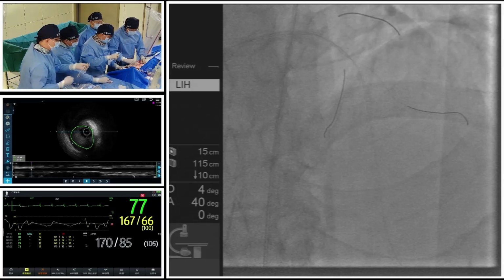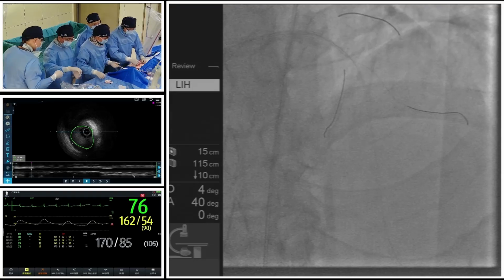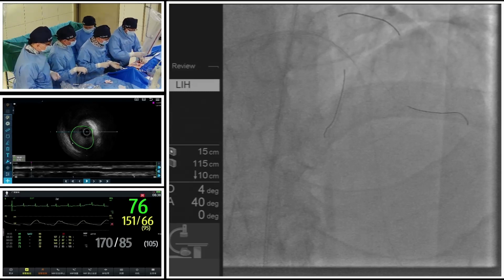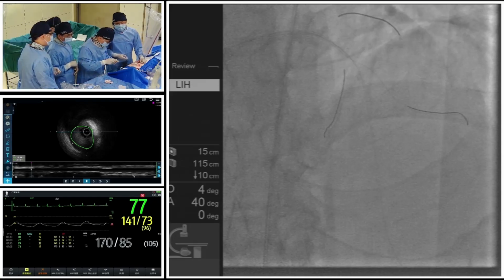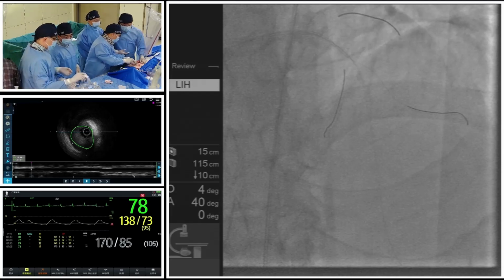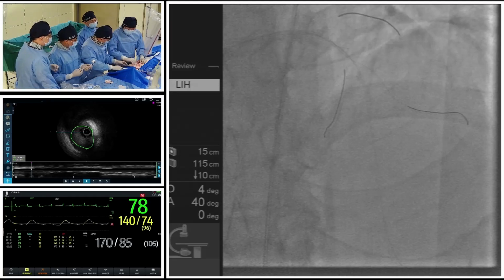And also I think that the diagonal, the angle is relatively friendly. So if we need to rewire the diagonal, I think it's relatively easier compared to the septal. Yeah, but the diagonal branch, the ostium is a little bit difficult to wire. So we will try our best to protect it. And certainly, let's see the result, if we could protect the septal branch.